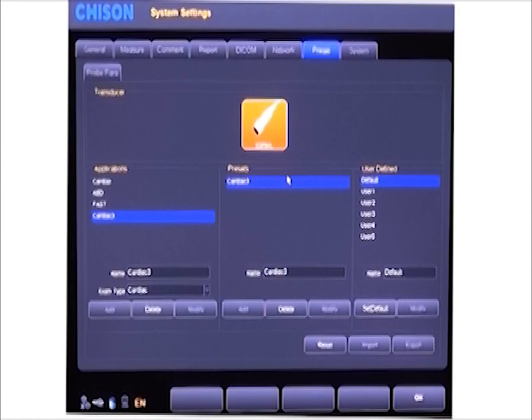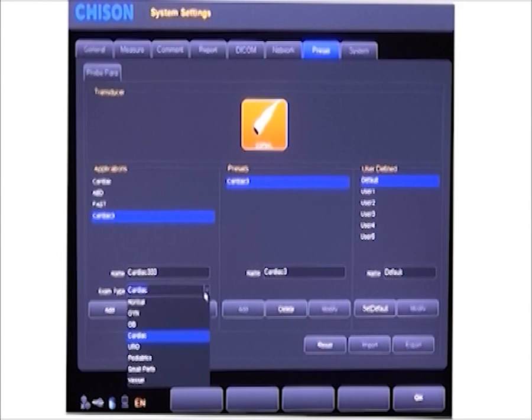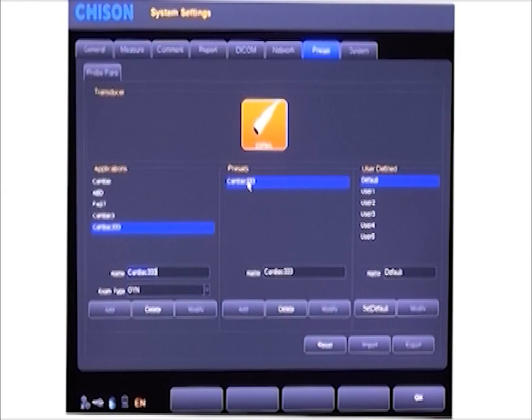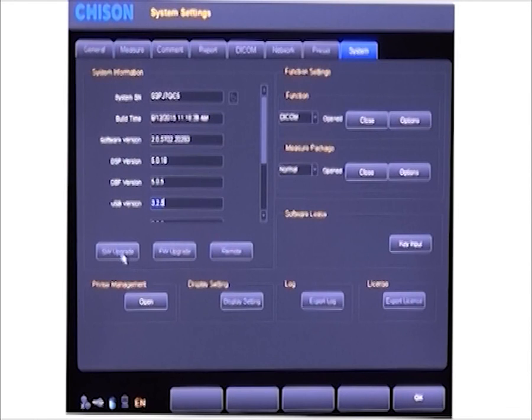The system has default presets, but here we can add new applications and presets according to the doctor's habits. It is also very convenient to upgrade the system. Press this key to upgrade the software, then press this key to upgrade the FPGA.